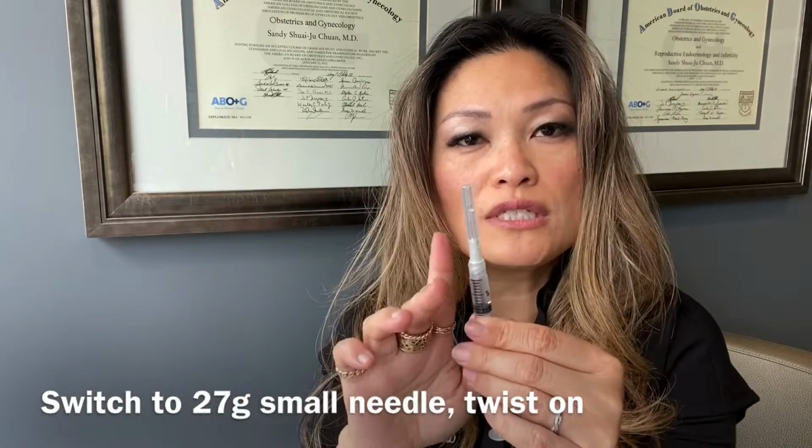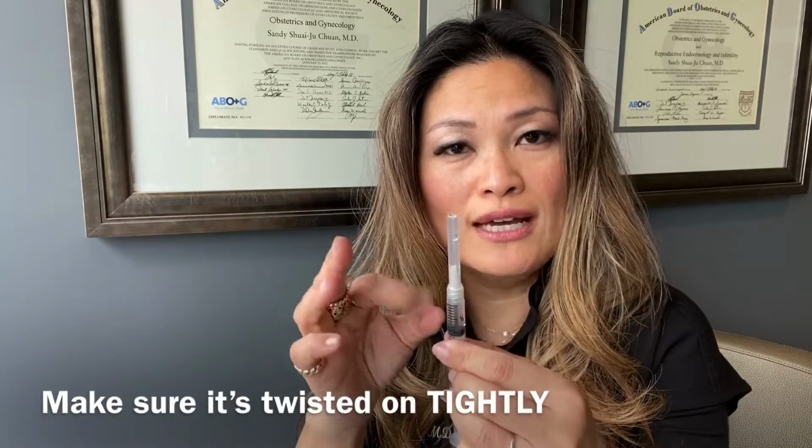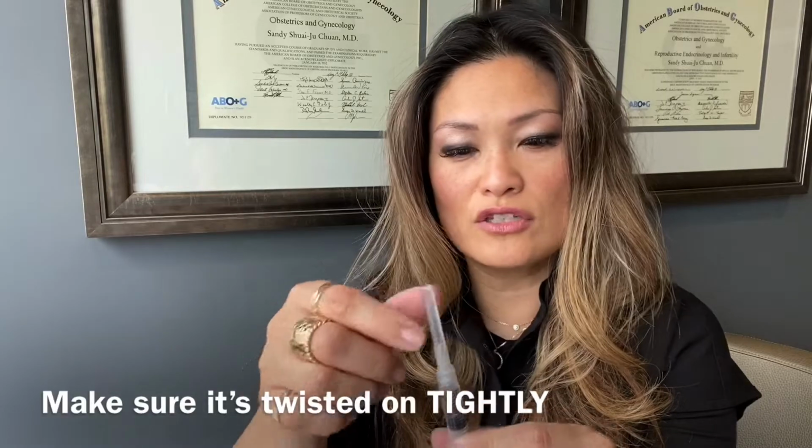Make sure that it's twisted on well, because what you don't want to happen is you go to push the syringe. If the needle is not on tightly, then the whole thing just pops off and then you'll lose all your medications. You have to start over.